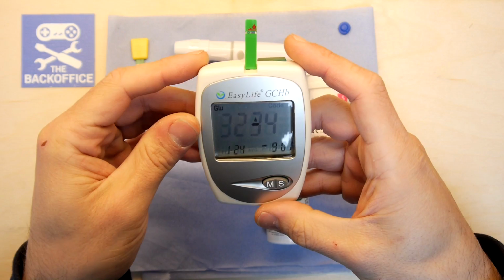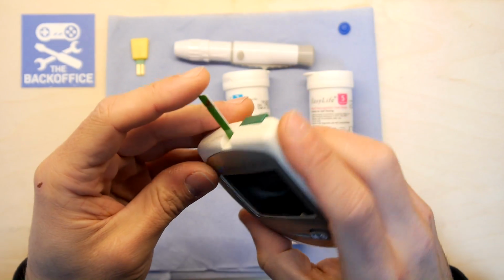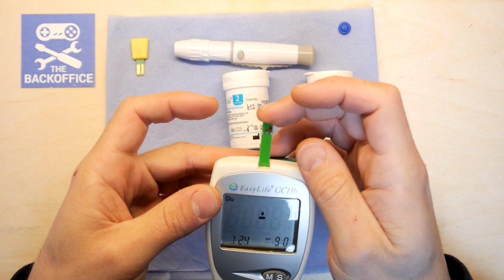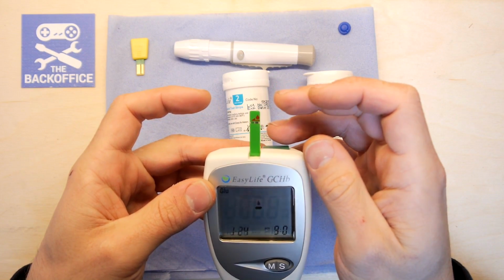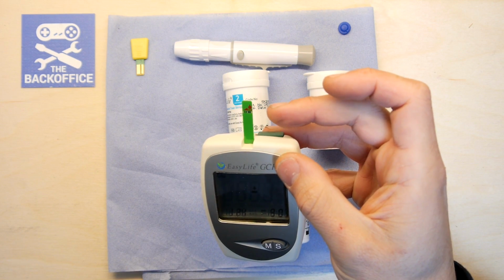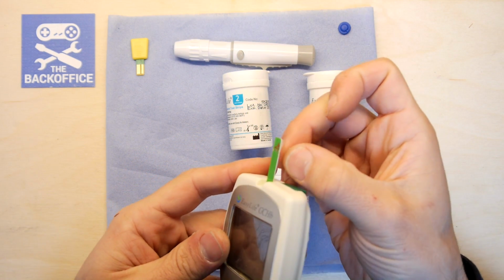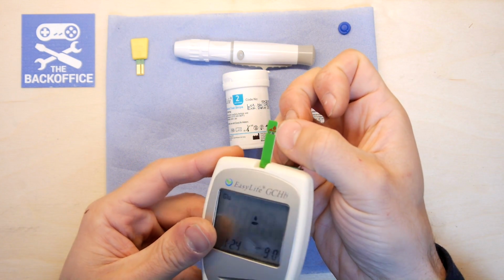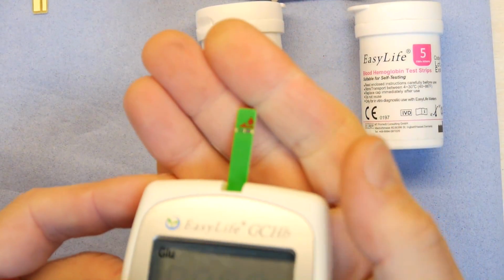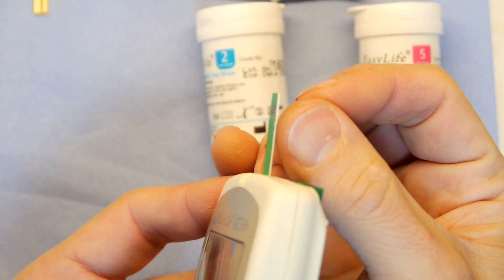If you're a sufferer of diabetes, this is where you want to go. Just looking here, it's got a window, so you obviously have to put blood into it somehow. I'm trying to work out which end you're expected to use. I think you're expected to put it on this side, so you can see the arrows going that way. We're going to offer some blood into that small area there, and hopefully it'll get sucked into the machine via capillary action. And just to show you, you can see a very slight window.